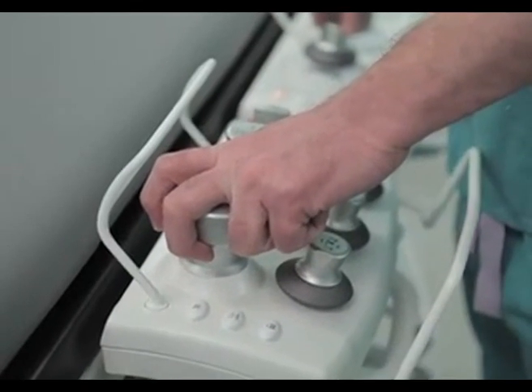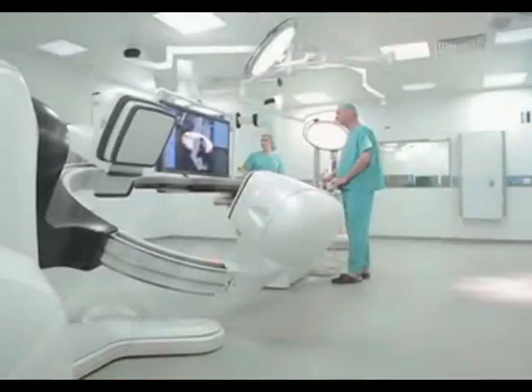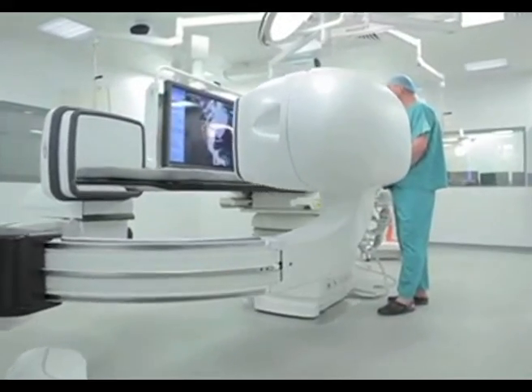Because the GE Discovery is entirely mobile in the room, it can be pre-programmed to different parking positions. So it makes it possible to have a lot of flexibility with other equipment in the room. We don't have it fixed somewhere. It can be moved, and that can be changed at any point in time.